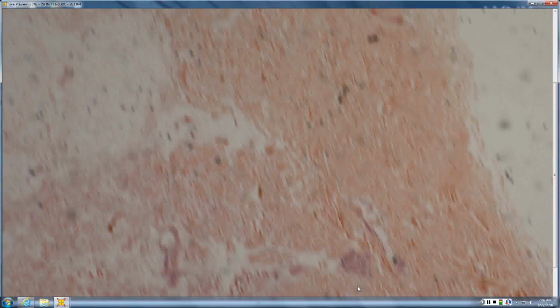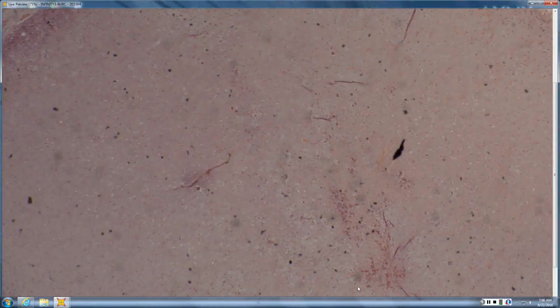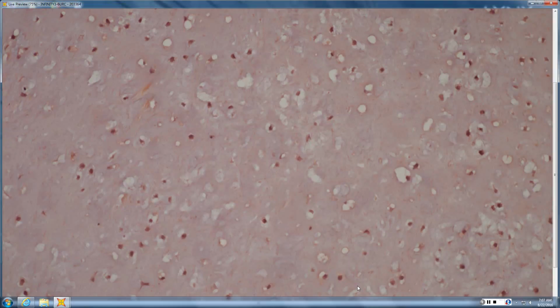And this is just a really deep nodule that's still in the skin, and from scan it's very bluish cartilaginous, but you don't really see as well a true tubular, almost syringomatous or eccrine gland proliferation within. You don't see that branching alveolar component. And so this one is not technically in the book. This is a solitary cutaneous chondroma.